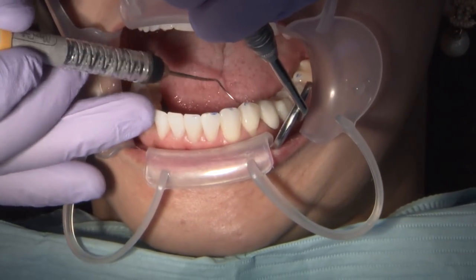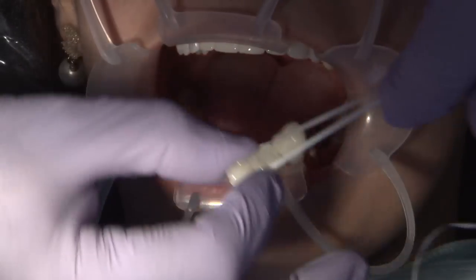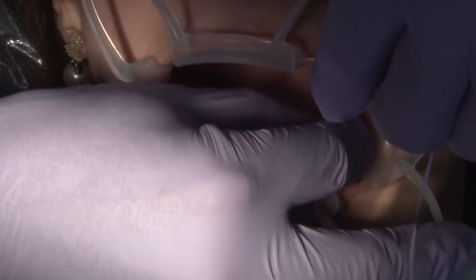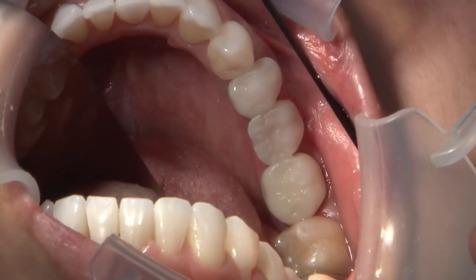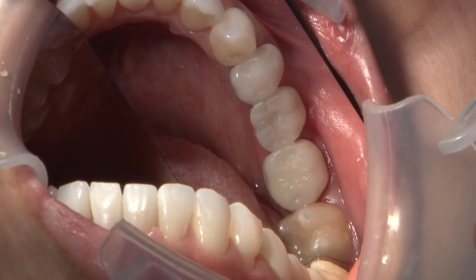Embrasures are clear enough to allow an instrument to pass through, and seating is completed with a floss strip pre-threaded underneath the pontic area for quick cleanup. The Fast Stent process is not just for occlusal assurance and path of insertion, but also to guide the acrylic reline in a direction that allows embrasures and pontic areas to remain open and hygienic.